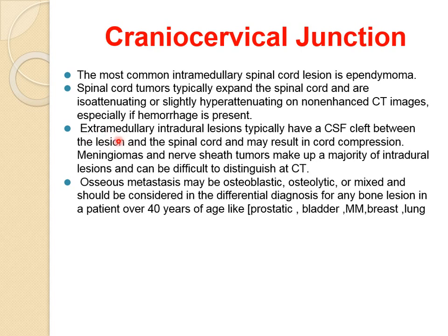While if it's extramedullary, where we see a CSF cleft, it's either meningioma or nerve sheath tumor. Osseous metastasis can also be seen here, either osteolytic, mixed, or osteoblastic. Most come from bladder, multiple myeloma, breast, lung, or prostatic cancers, especially if the patient is over 40 years of age.